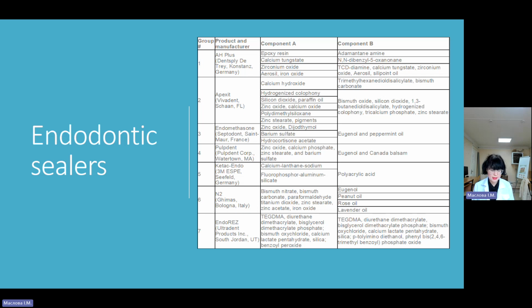Sealer flow may be affected by root canal morphology, the core root filling materials, dentine tubules, and the smear layer. Increasing the rate of sealer insertion may increase volumetric flow and reduce the viscosity of the sealer.